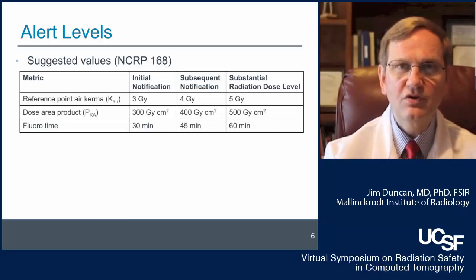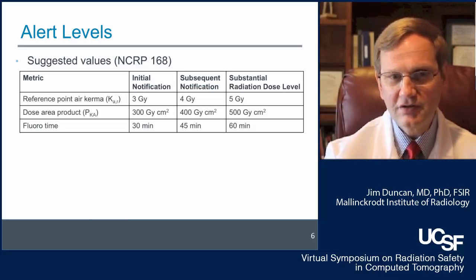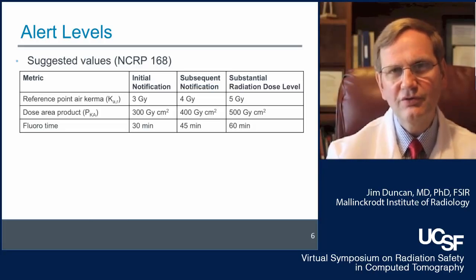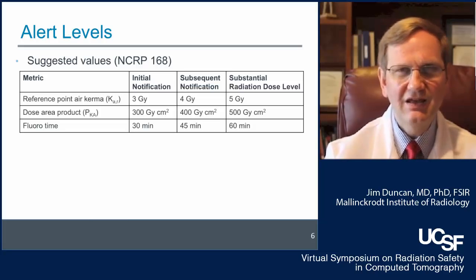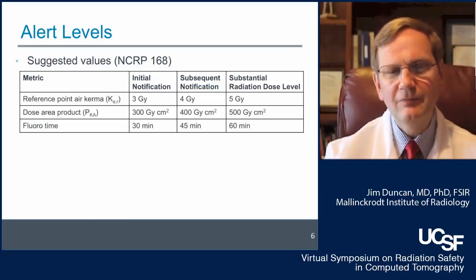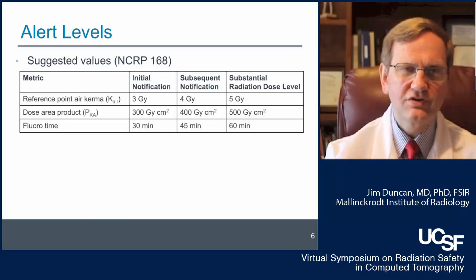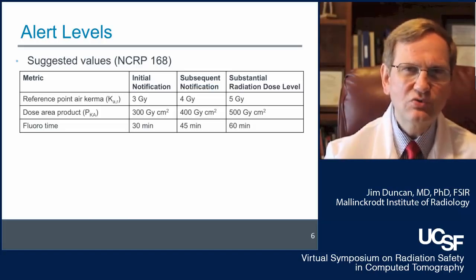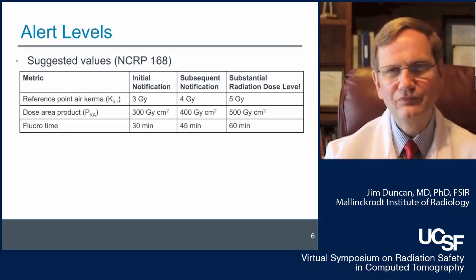You can also be monitoring dose area product. It's not recommended to be using fluoroscopy time, although they did supply numbers in case you're working in a room that doesn't allow monitoring of reference point air Kerma or dose area product. But you shouldn't be doing complex procedures in rooms without that recording capability anyway.